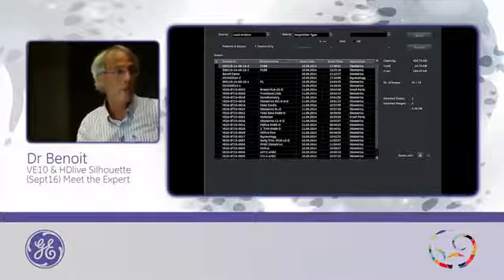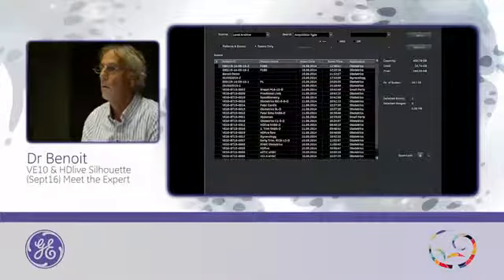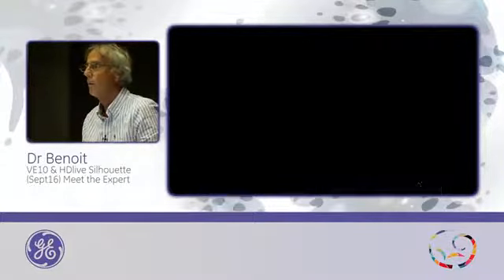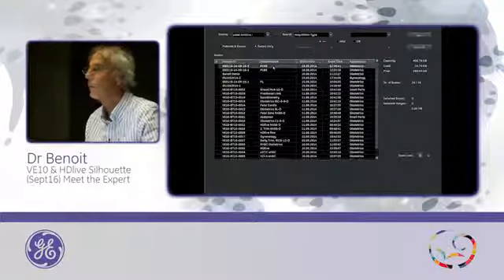No, I think it's better with the light. We don't need the... Okay. Sorry. Archive. This one.